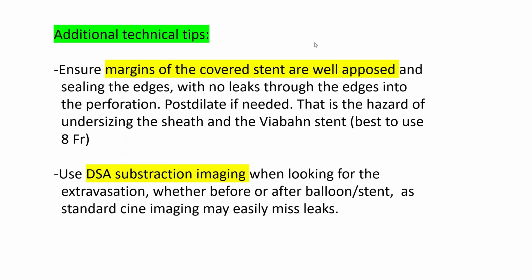Additional technical tips on treating an iliac or femoral extravasation. Always ensure that the margins of the covered stent are well opposed and sealing the edges with no leaks through the edges into the perforation. Post-dilate if needed, if those edges are not well sealed.